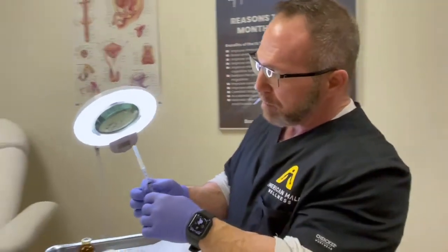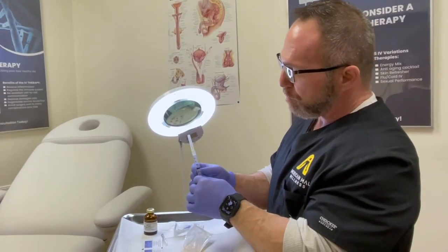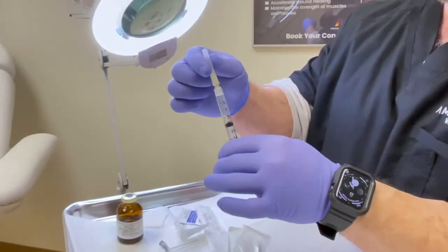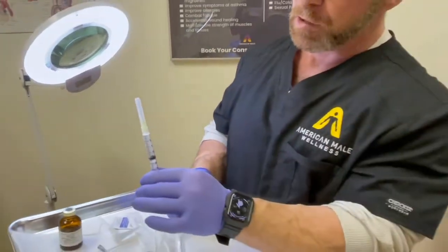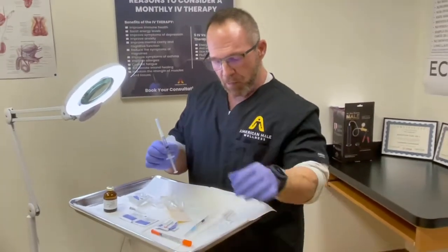This larger syringe also comes with a needle on top for drawing. You can remove it and use a different needle for the actual injection, just as with the smaller syringe.